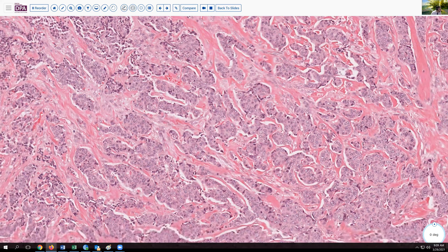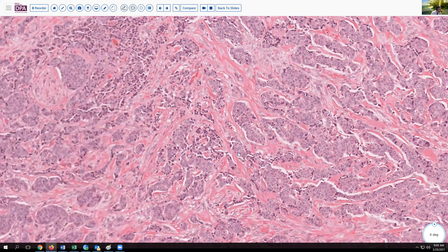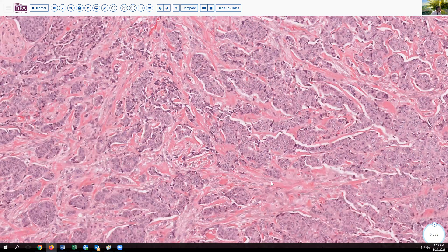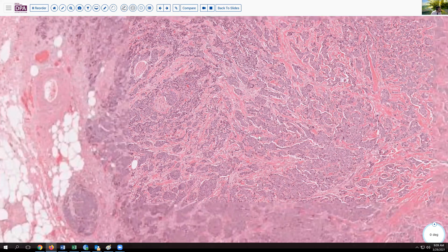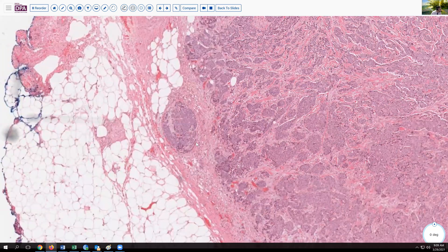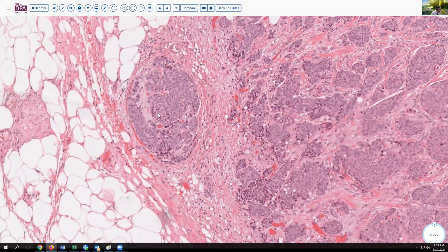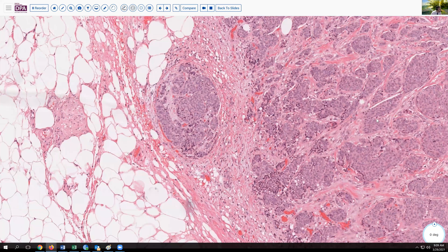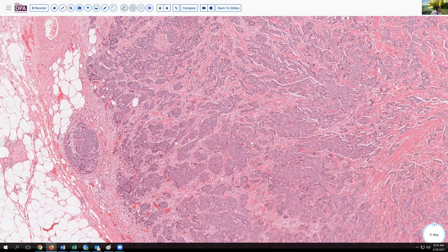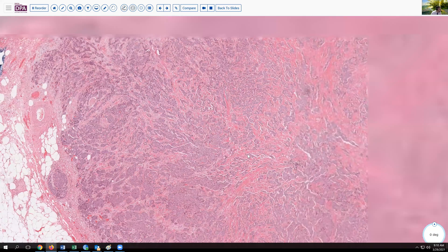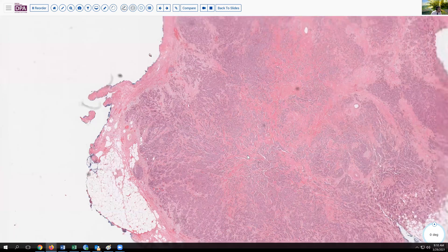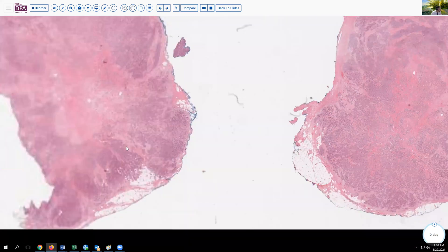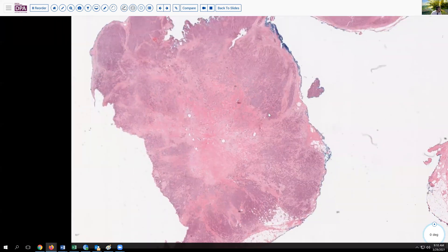There is ample eosinophilic cytoplasm and mostly a fairly solid pattern of growth with relatively uniform nuclei. Seeing this type of pattern, one might wonder: are there any primary tumors in this area that could give this pattern, or are we dealing with a metastasis? Non-keratinizing squamous carcinomas might have some of this pattern, but they would have a surface connection. Other adnexal skin tumors are less likely, but certainly breast-type lesions could have this appearance. We don't see any in situ lesion, though such can be seen on occasion. And so we might go to immunohistochemical markers. This lesion was strongly positive with CK7 and also expressed hormone receptors for estrogen and progesterone, suggesting that this is a mammary-type or mammary-like carcinoma arising in the vulva.